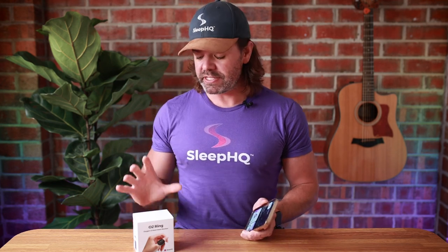G'day mates, today I'll teach you how to set up and sync a Sleep HQ O2 ring with our brand new Sleep O2 app. Let's do it.